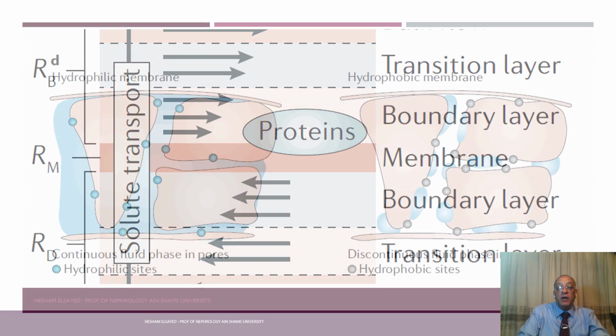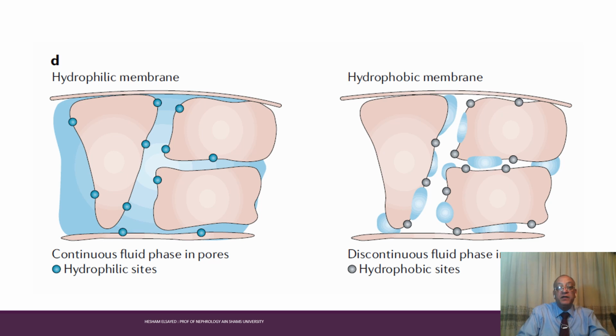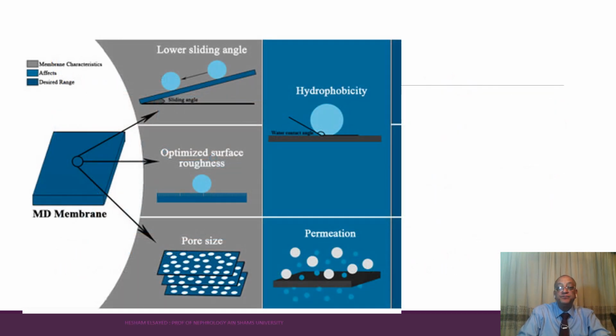So a more hydrophilic membrane is required, smooth like an endothelium. A more hydrophobic membrane will induce clotting and protein fouling and decrease the overall dialyzer performance. Increasing the pore size will increase the permeation, while increasing the hydrophilicity will improve the blood-membrane contact.